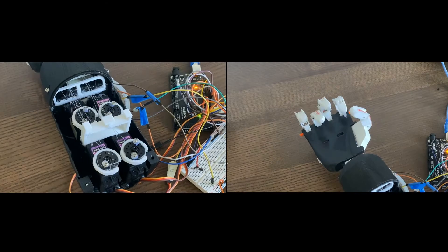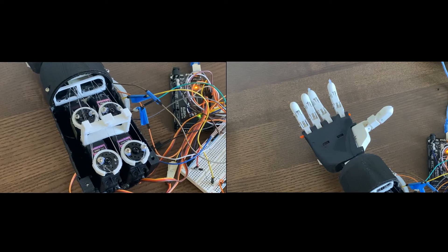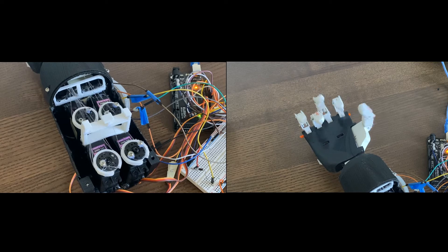The fingers move based on string tension. A string is wrapped around the horn of the servo motor and travels all the way up to the tip of the finger. When the servo motor rotates, it pulls on the string and the finger coils.